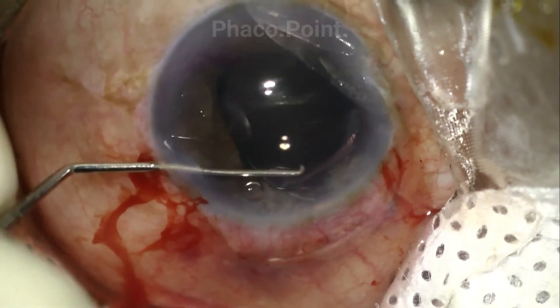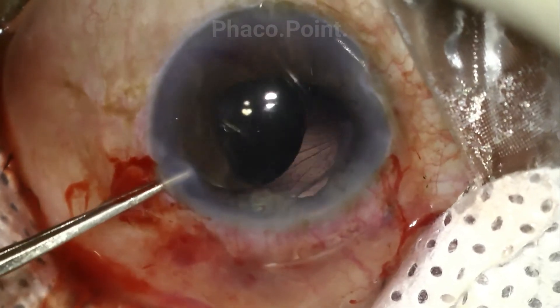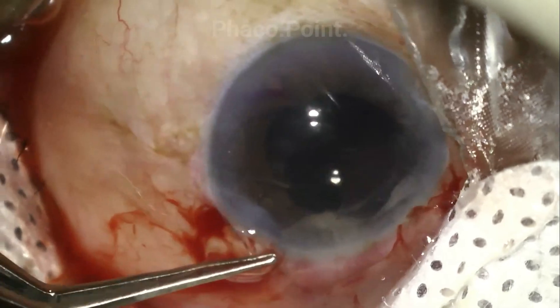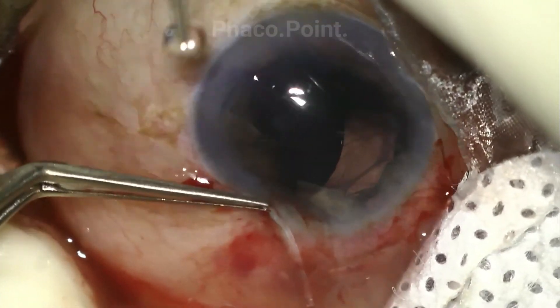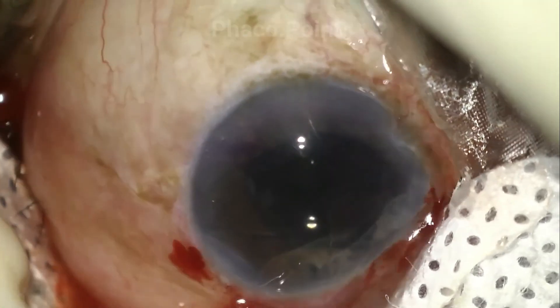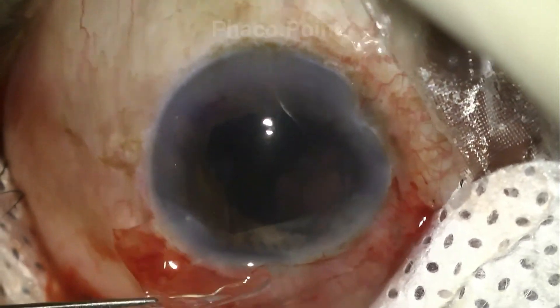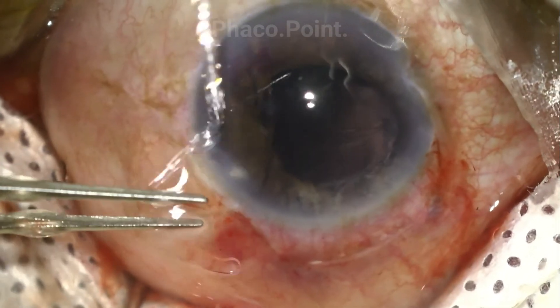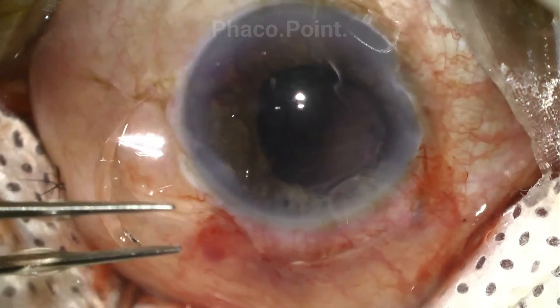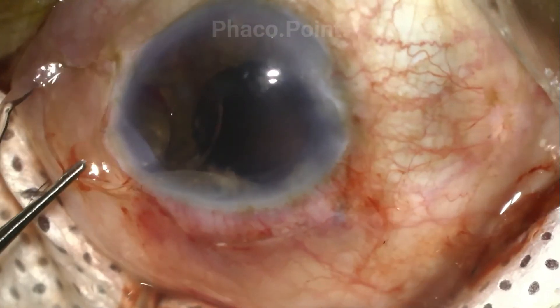One haptic is held close to the optic-haptic junction and pulled out through the main incision. The optic is then re-grasped and a part of it is pulled out along the cut edge. The IOL works as a fulcrum, rotating upon itself until the entire IOL is exteriorized as demonstrated in the video.